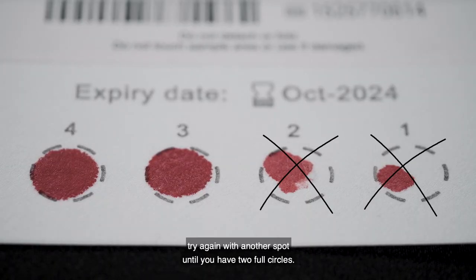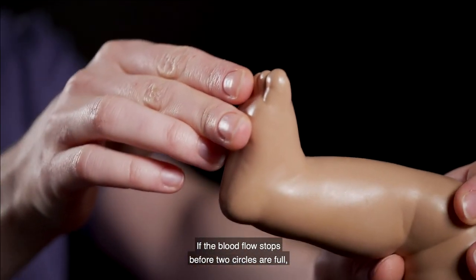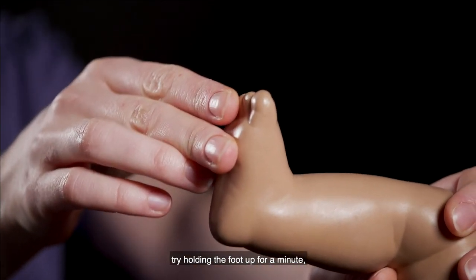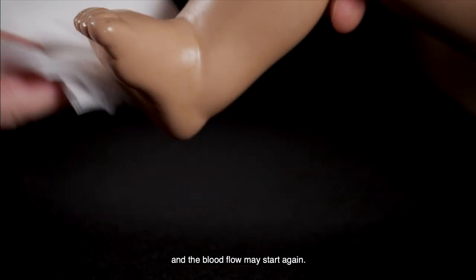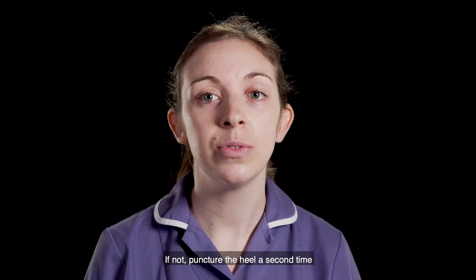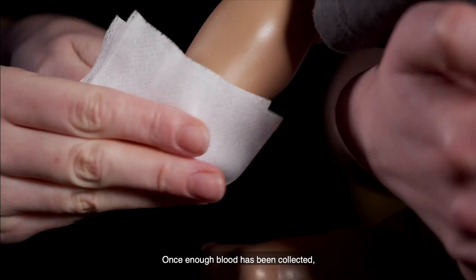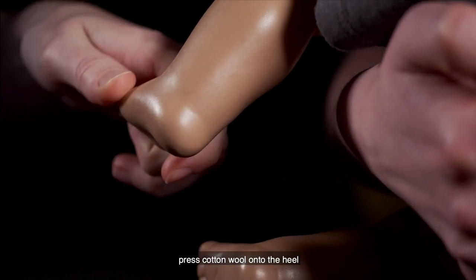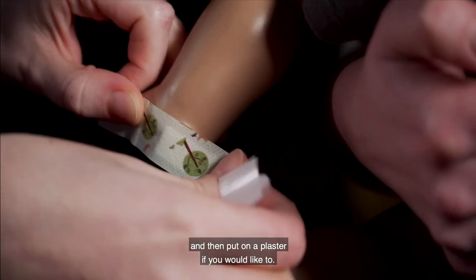If a circle is not full, try again with another spot until you have two full circles. If the blood flow stops before two circles are full, try holding the foot up for a minute, then lower it and quickly wash the heel with cotton wool and water — the blood flow may start again. If not, puncture the heel a second time or try the other heel. Once enough blood has been collected, press cotton wool onto the heel until the bleeding has stopped, then put on a plaster if you would like to.